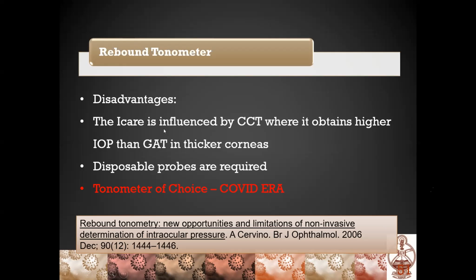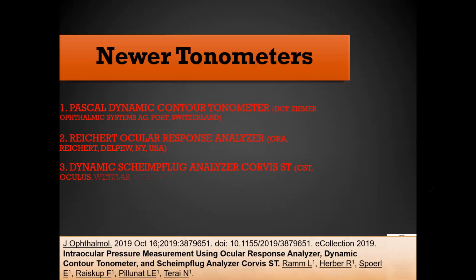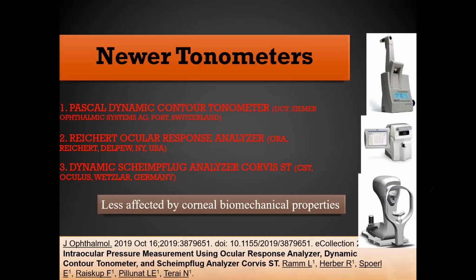Now coming to other newer variety of tonometers which are available nowadays. The first one is the Pascal's dynamic contour tonometer. Second one is the ocular response analyzer. And third one is the dynamic Scheimpflug analyzer, which is Corvis ST tonometer. Now all these tonometers, they are less affected by corneal biomechanical properties, and that is the best advantage with these tonometers.